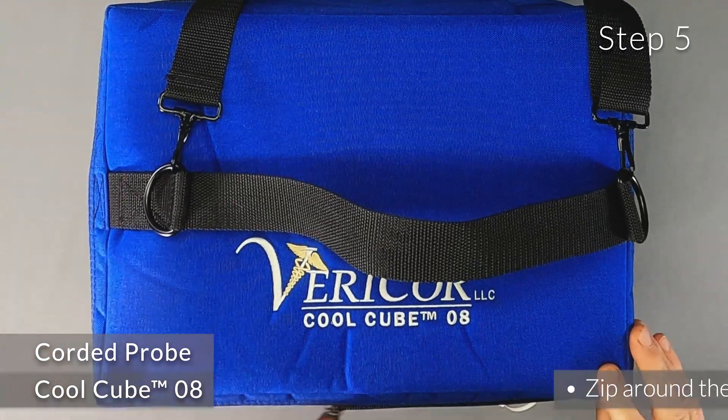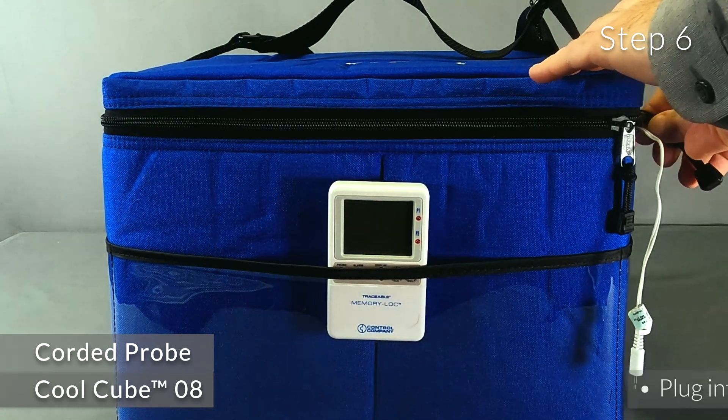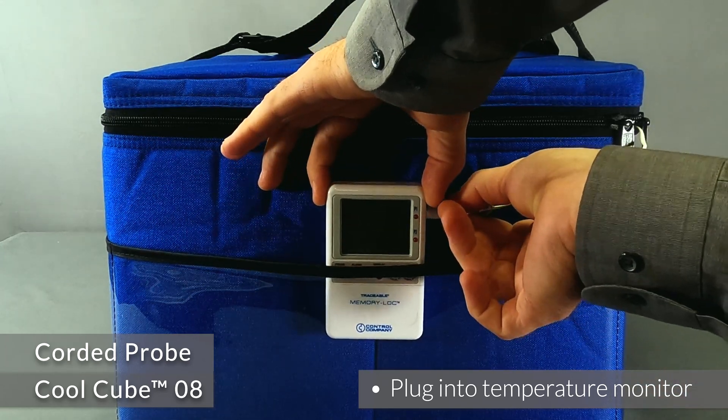Step 5: Zip the two zippers around the cord where it comes out. Step 6: Plug the cord into the temperature monitor and place it in a pocket of the CoolCube.